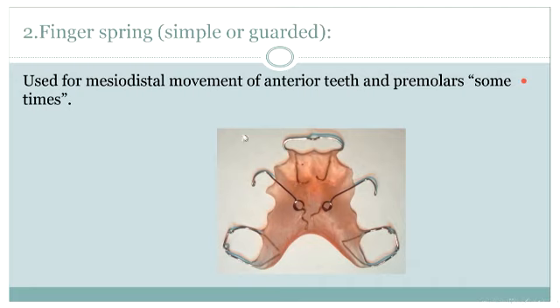If the tooth is outside the arch or has an ectopic eruption, we do not advise using this type of spring. Therefore, we can use different cross sections of stainless steel wire. The diameter of a spring is from 2 to 3 millimeters, also present here in order to maintain the tooth within the line of the arch.